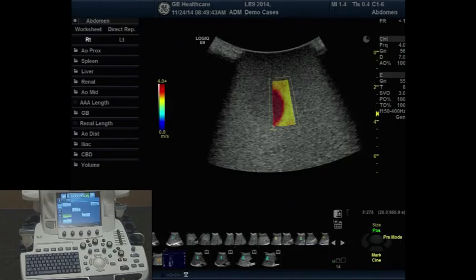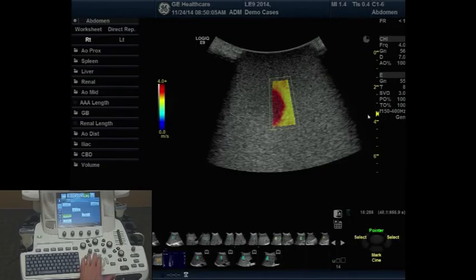So you'll notice now within the region of interest I have a dark red color for indicating stiff lesion material and yellow indicating slightly softer material. Another important piece of information to realize is the clock you see spinning in the upper right hand corner up here. This indicates how often we are updating the frame of shear wave elastography. So basically at noon a new frame will get updated on your display.